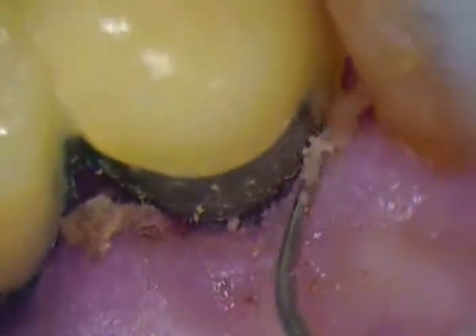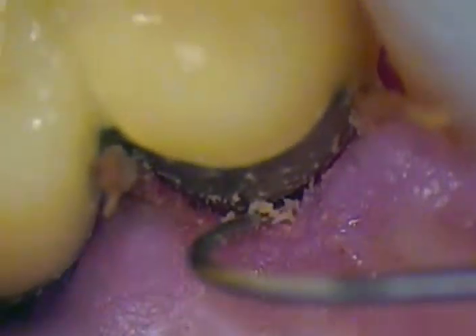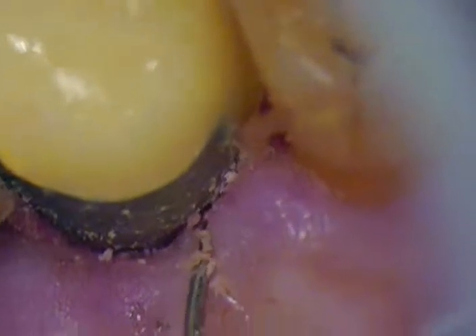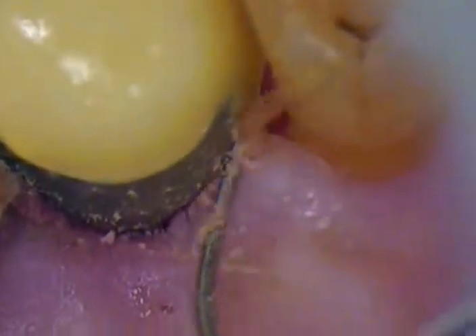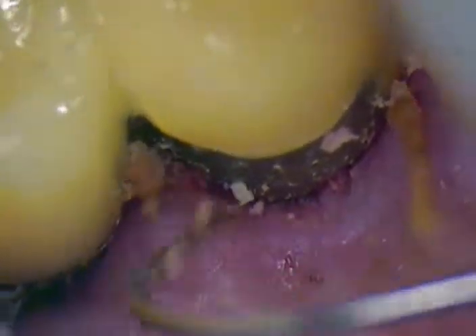Look at how when I pull this up, all that cement is coming up right with it. There's a little extra cement right here, but you're home free — you don't have any issues trapping the cement down in there. I wanted to show you this image so you can see that prevention technique works so well.